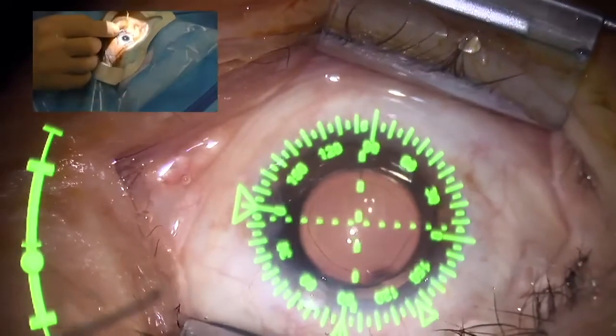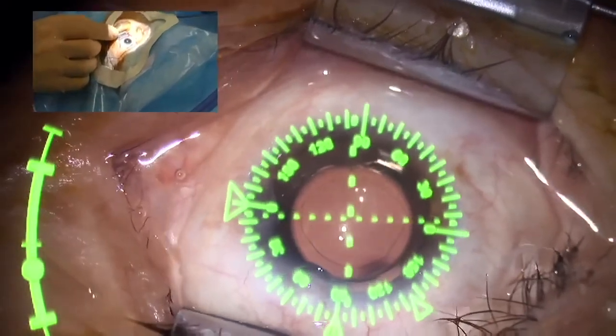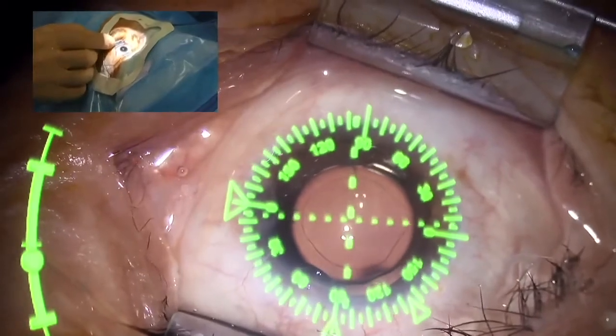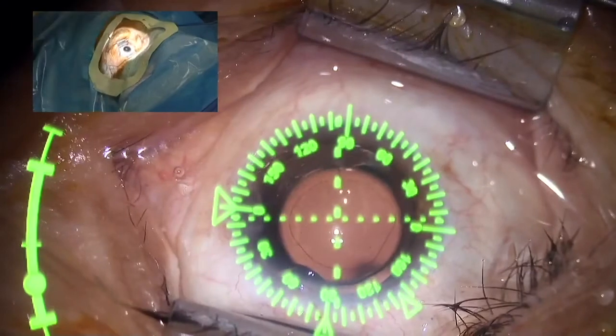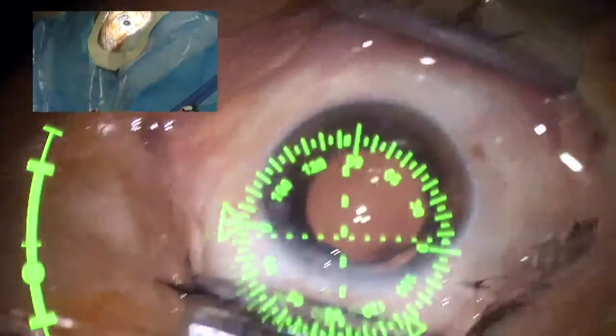So now the eye is prepared for the multifocal add-on IOL, which is also injected through a cartridge of 2 millimeters.